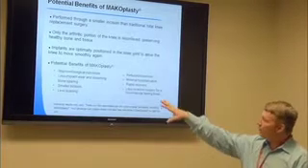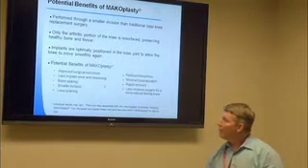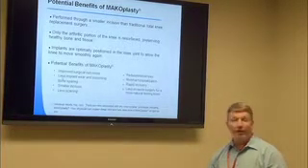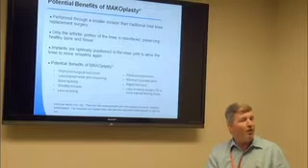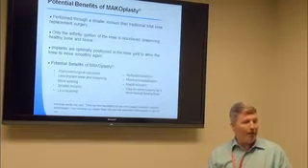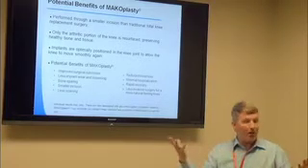Potential benefits, we've seen improved surgical outcomes. Because we put the implants where they need to be, we have seen less implant wear and loosening. That's what affects the lifespan. If you start to wear the implant out or it starts to become loose, that's what judges the lifespan of an implant. And so if we get it in perfect position, they last a lot longer.